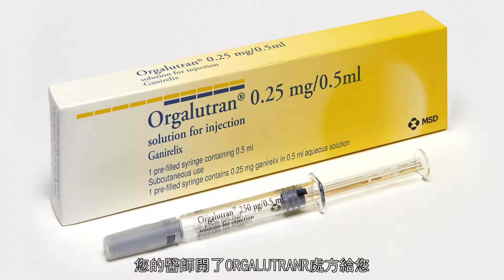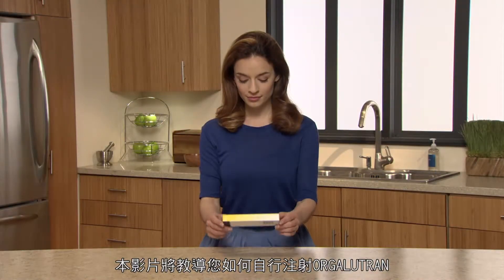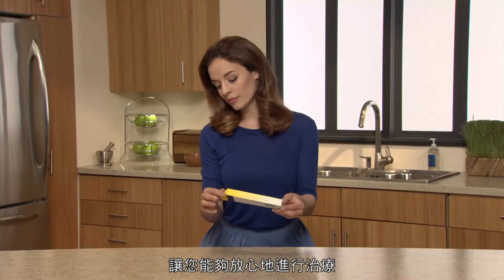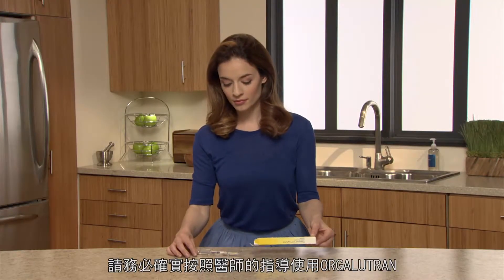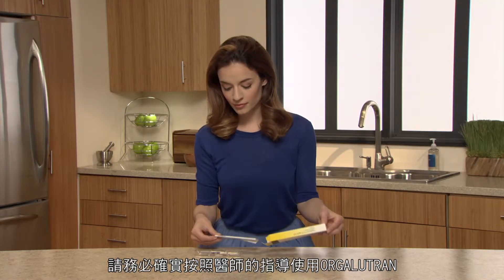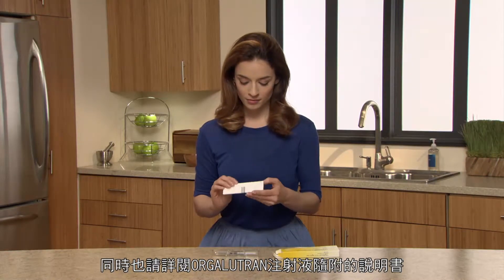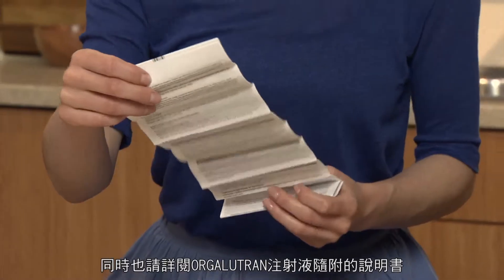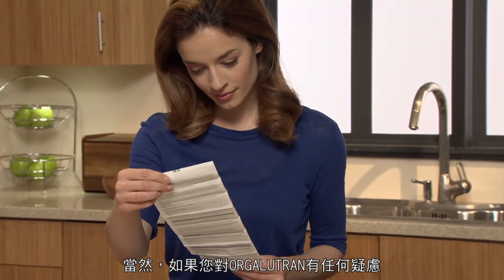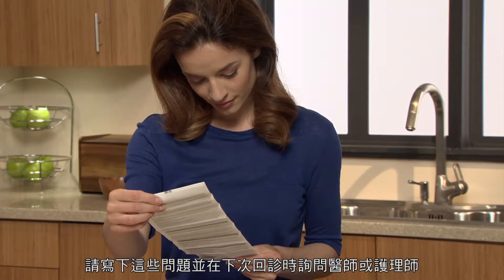Your doctor has prescribed Orgalutran. In this video you will learn how to give yourself an injection of Orgalutran so that you can proceed with confidence. You should always use Orgalutran exactly the way your physician has told you. You should also read the instructions that are included with your Orgalutran injection. Of course, if you have any more questions about Orgalutran, write them down and ask your doctor or nurse during your next visit.